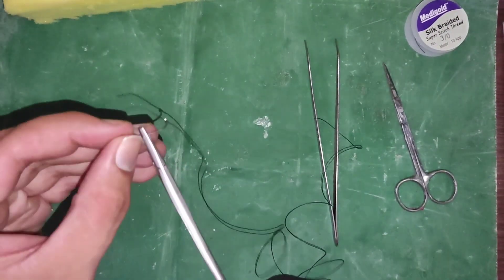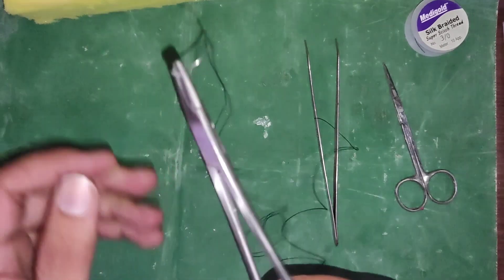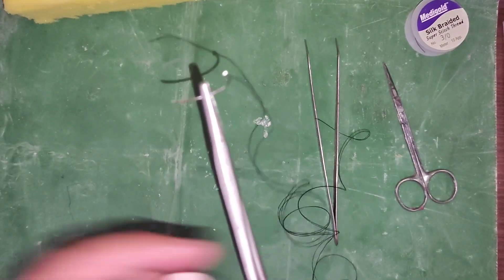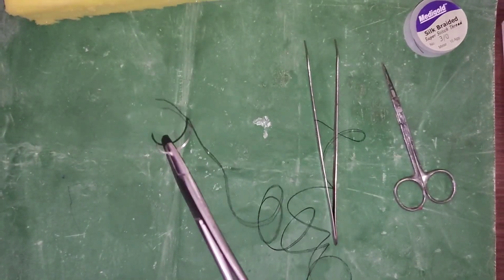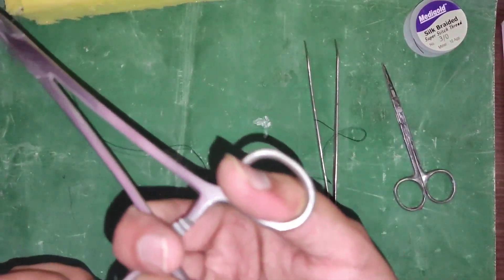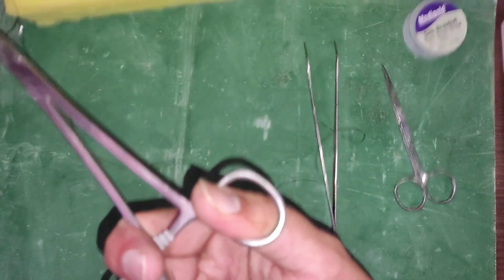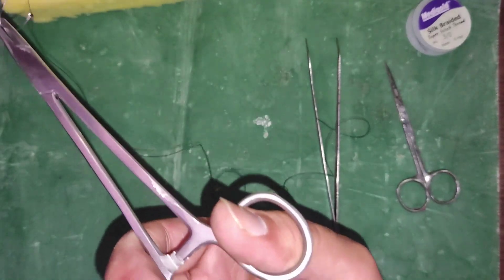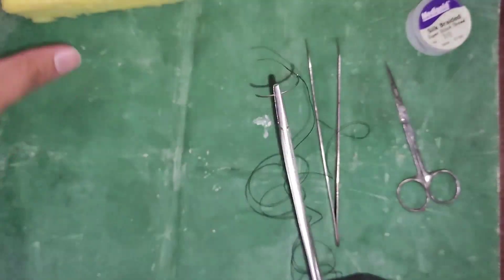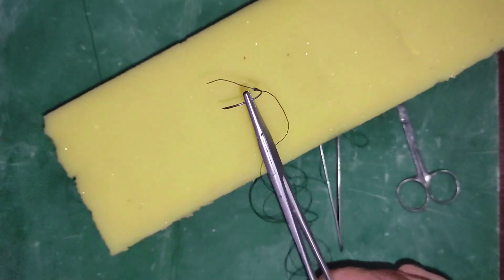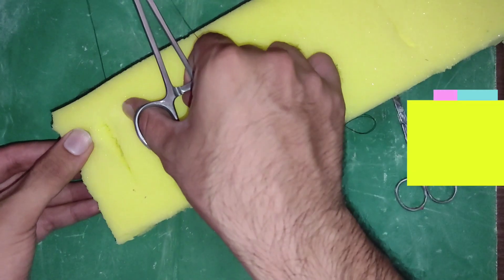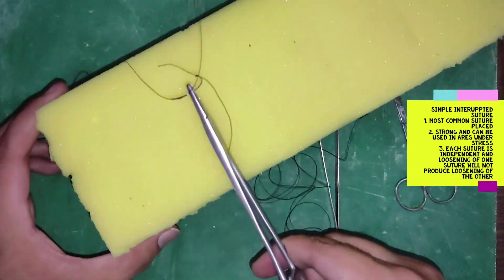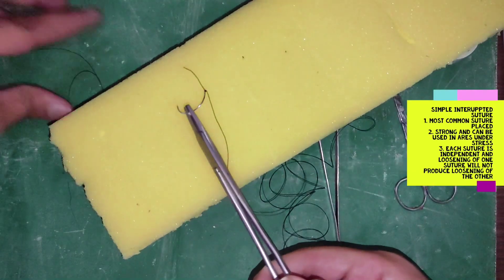An important point to remember: the needle should be held at approximately one third distance from the eye, and two thirds from the needle point. Now let's begin with the first suture, which is the simple interrupted suture.